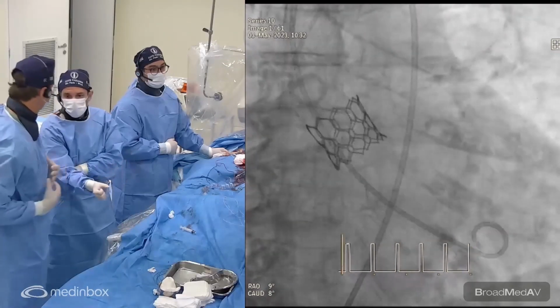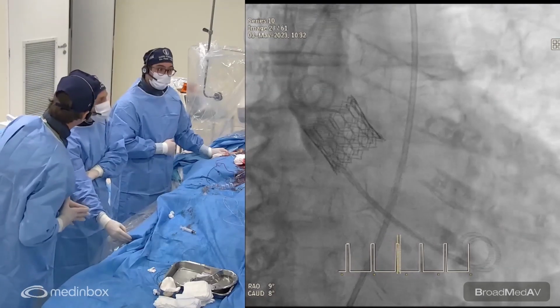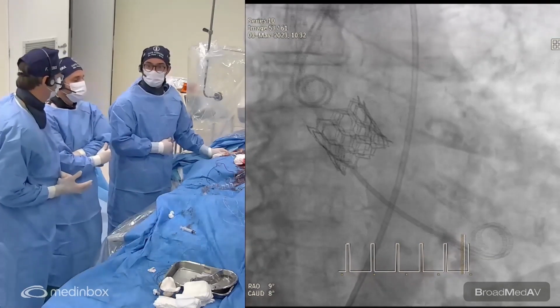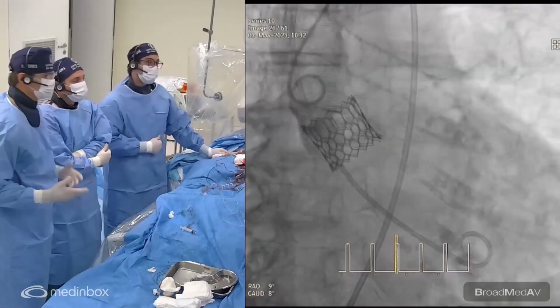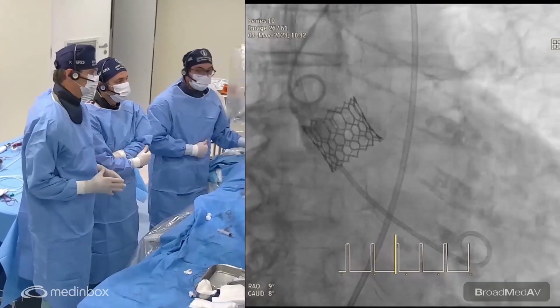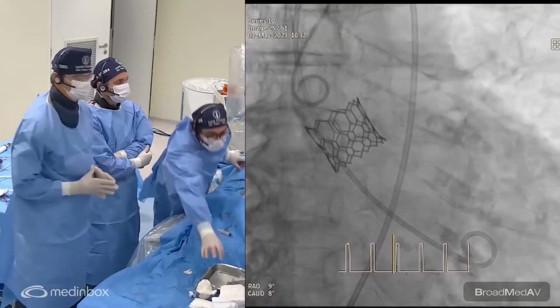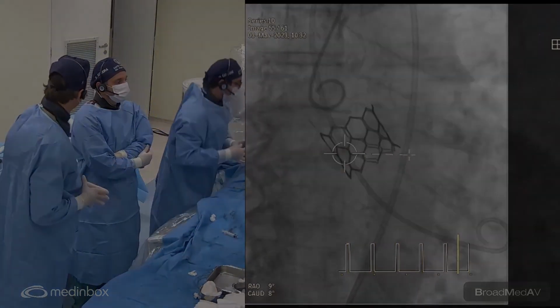I think we got a good result. If you ask my opinion, I would stop. Do you agree, Alberto? Yeah, I do agree. I think we have good results in echo, good results with the hemodynamics, just mild aortic regurgitation, and we cannot see it in the angio. I would stop.